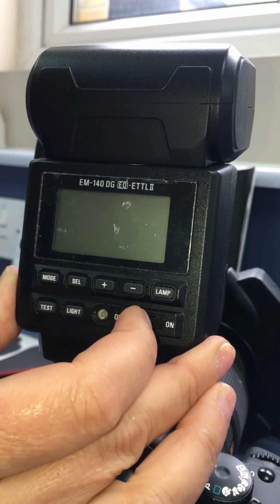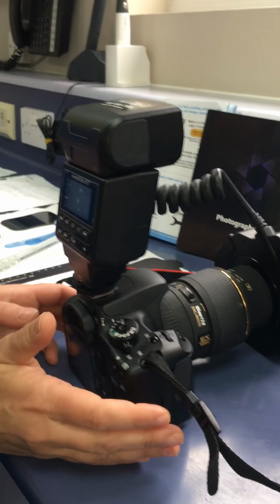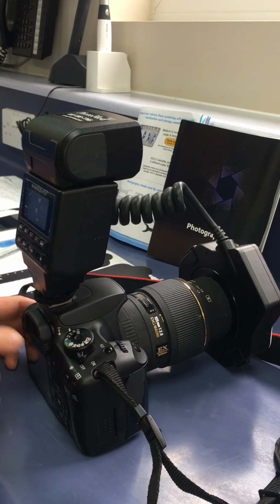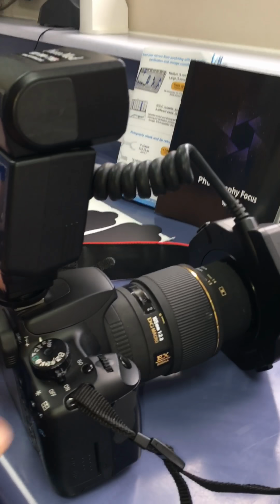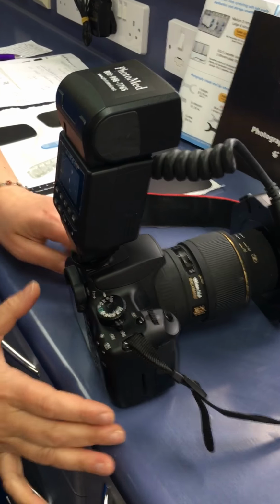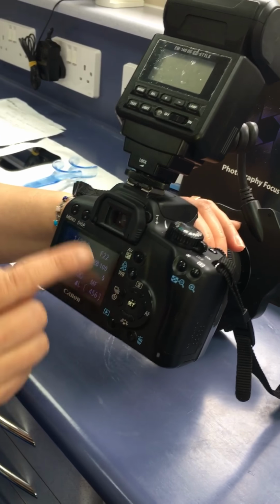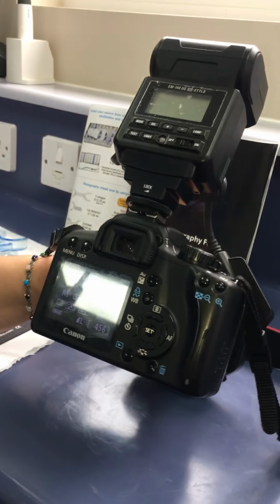Now, setting the camera for dental photography is very precise, isn't it? So you need to put this on manual. Can you switch it on? Okay, and put that on manual. Once it's on manual, you have to make sure that you've got the correct settings on the screen. F stands for the aperture size.